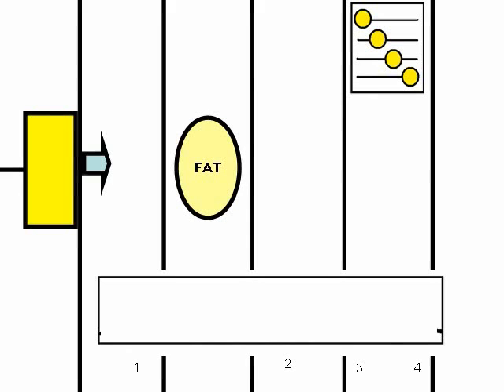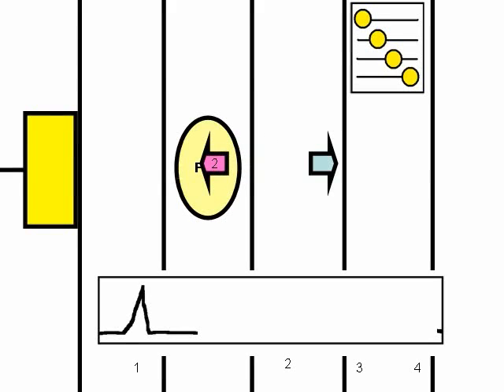But if there is something that is slow, like fat, the first echo is at the correct distance, but the propagation speed in the fat is less. The second echo was produced, but the same happened. The propagation speed of the echo is slow in the fat area.